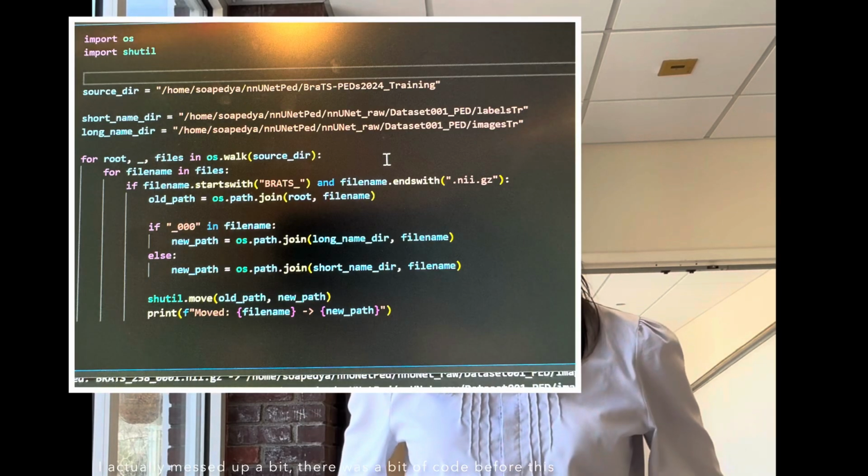Finally, nnU-Net, a self-configuring model based on UNet architecture, was used. The difference between nnU-Net and UNet is minimal, except there are optimal parameters chosen for nnU-Net, and also optimal preprocessing applied to the datasets. In addition, a specific folder structure was required for nnU-Net, so here's the code that was used to change the file structures. However, in remote GPU services, this code was uploaded and run over there.